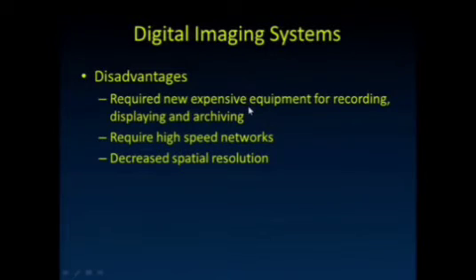Unfortunately, it really required a lot of new, expensive equipment, and so it took a while, and there was kind of a natural transition from film to CR, and now to some of these more direct digital systems, because CR most closely matched what was previously being done with film, and so it was kind of a natural progression there. We need some high-speed networks, of course.